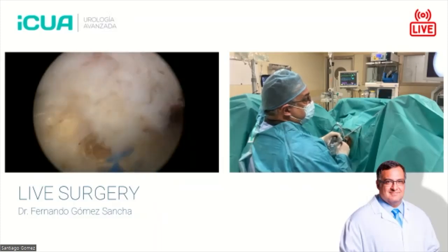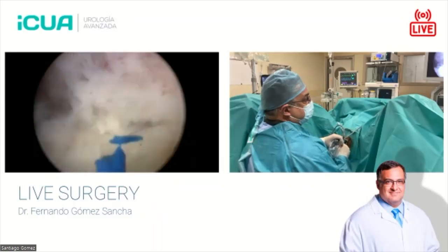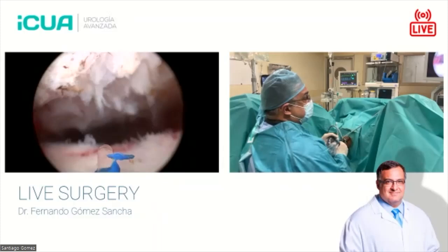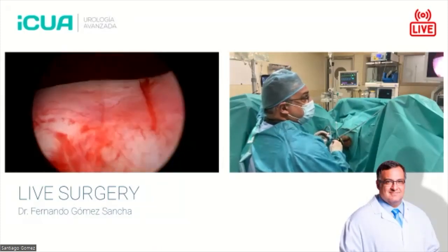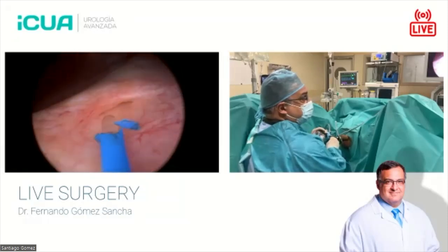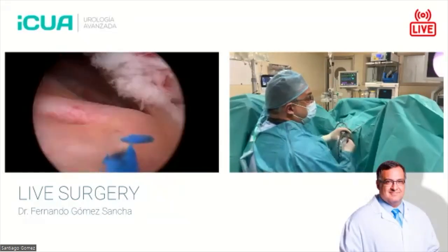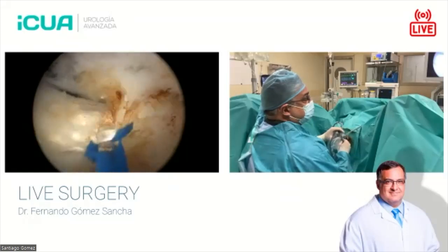But for that, you must be absolutely sure that there's no attachment to the bladder neck. And here we are finishing. You can see this side. We can see this UO, probably around here somewhere. No, we saw it before here. And now we can see this side, and we can see the UO here. So let's finish the enucleation.